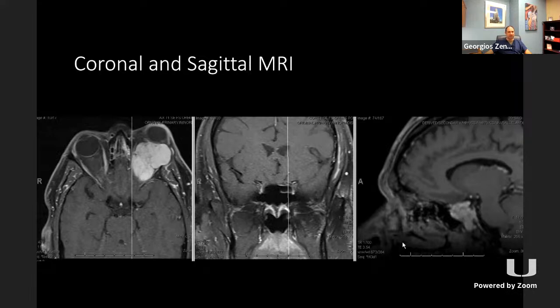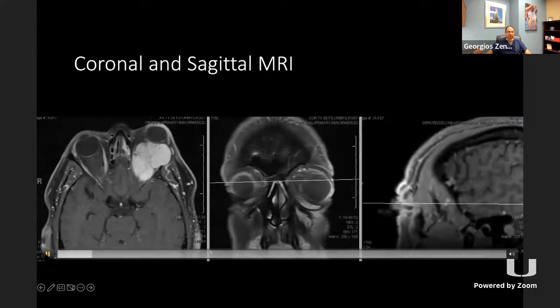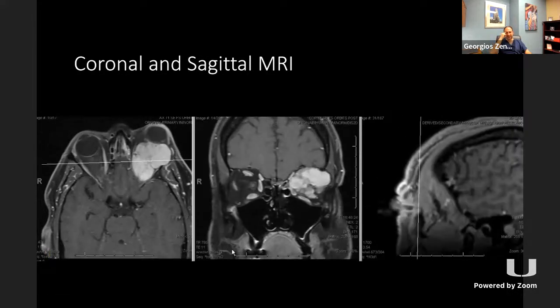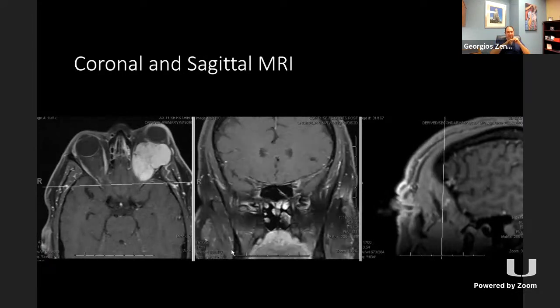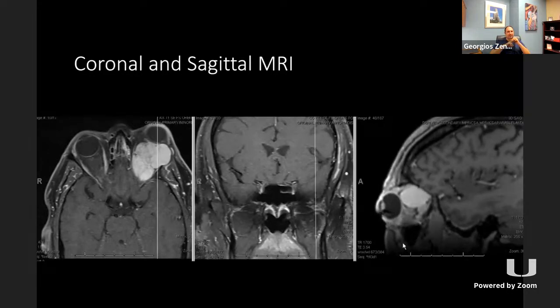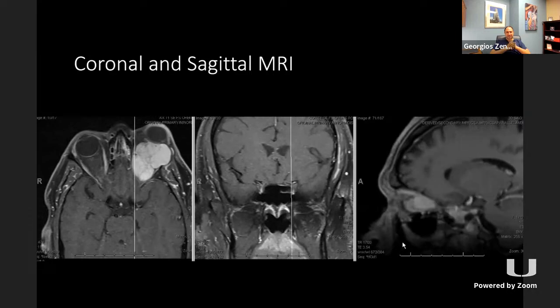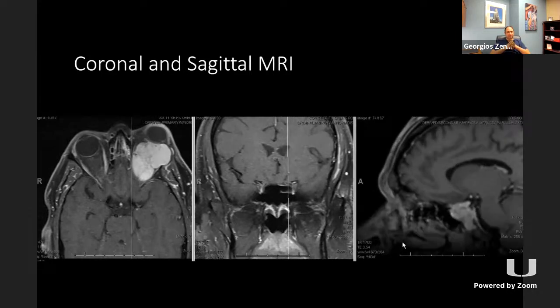Studying the images a little bit more in detail, I think the main surgical corridor here is going to be between the superior rectus and the lateral rectus. I think that's where it comes closer to a surface. So do an eyelid incision, gaining that corridor, but then perhaps extending more medially and creating another corridor medial to the superior rectus, as Dr. Mo said, to have a better understanding and visibility of the medial aspect of the tumor as well, and try and tackle it like that.